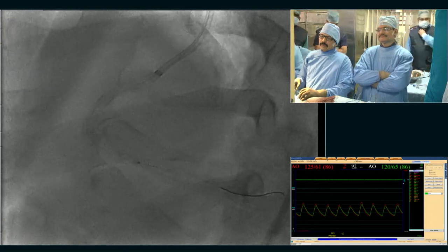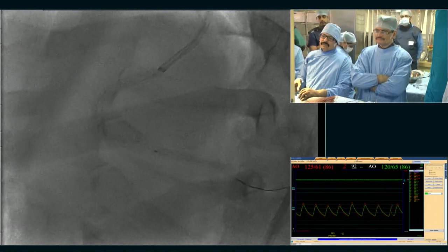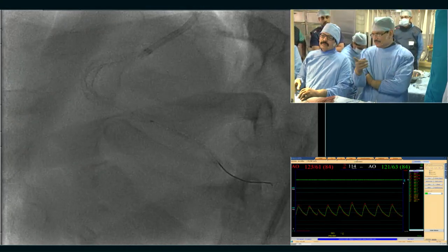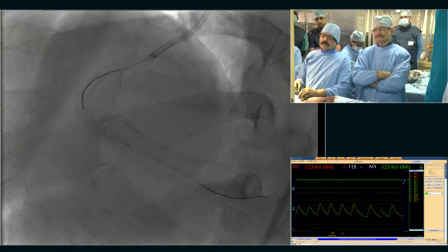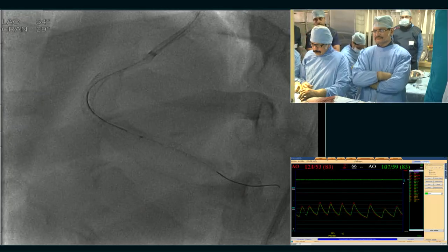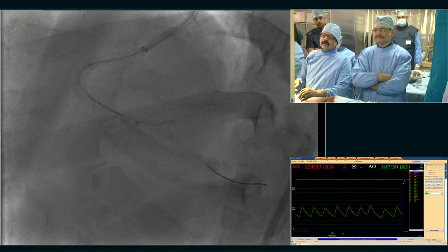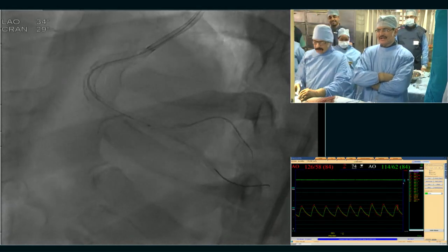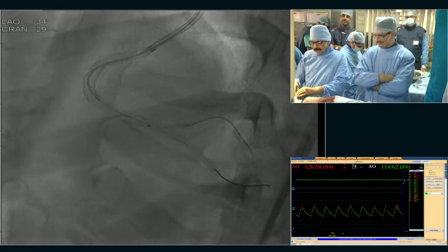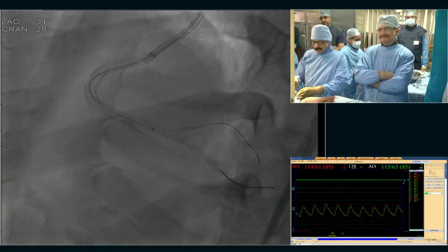I'm not sure whether a polymeric coat would be useful, because I think the 3.5 NC balloon will dilate everything and these caps are softer. Hence, I think the coat will be damaged with torqueability. In this case, we need a trackable wire. Fielder XTR, did you cross with it? No, it is a Whisper wire, the hydrophilic coated Whisper.